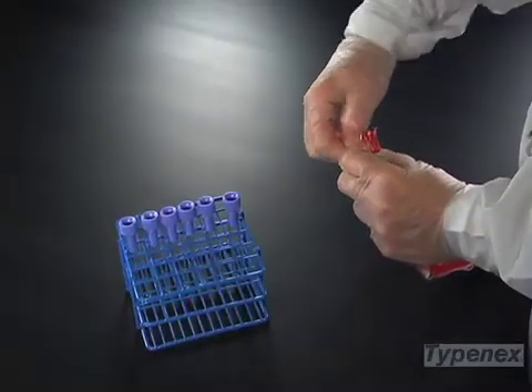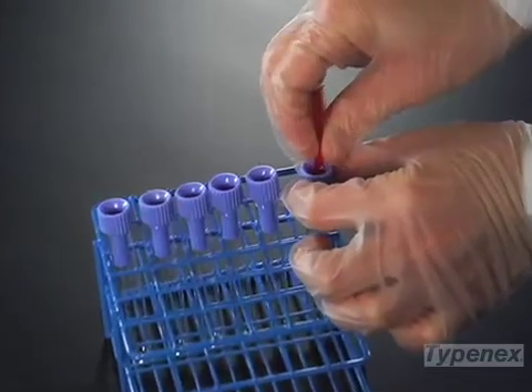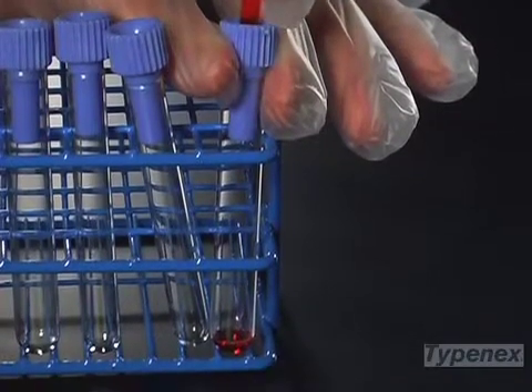Insert a blood segment into Typesafe and gently press until the needle has pierced the segment. Now apply pressure to the segment, forcing blood into the test tube. Do not squeeze until the needle has pierced the segment.